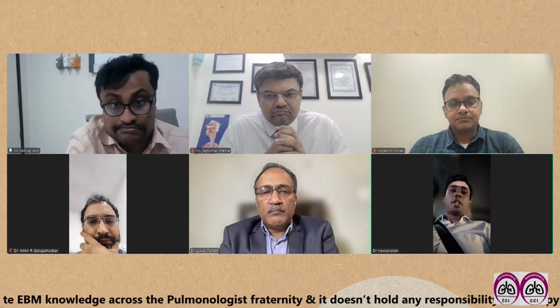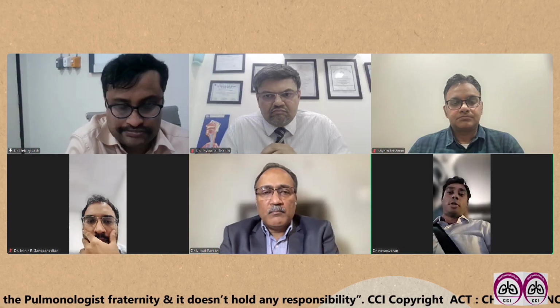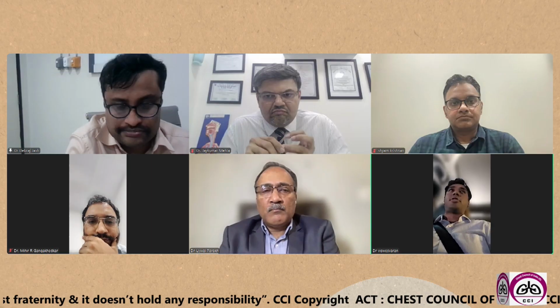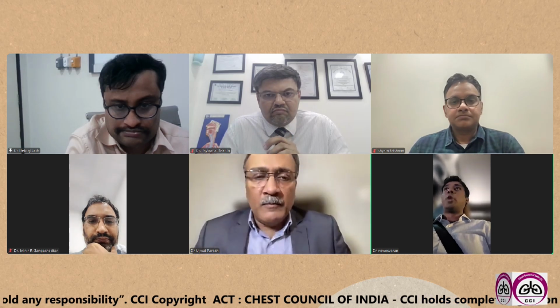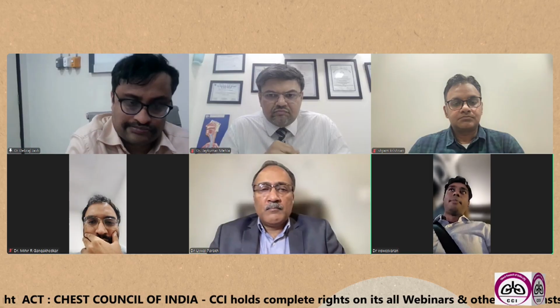And regarding the Pentax, the advantages, Pentax comes with a dedicated ultrasound machine. So the image you get with the Pentax scope is supposed to be equivalent to that of what you get in an ultrasound machine. But unfortunately, I have not purchased one, so I have not used it as a standalone scope. But in conferences, we have seen and we have used it, and that is also quite a good scope. End of the day, I'll just finish it in a minute because I don't want to take much of the time.